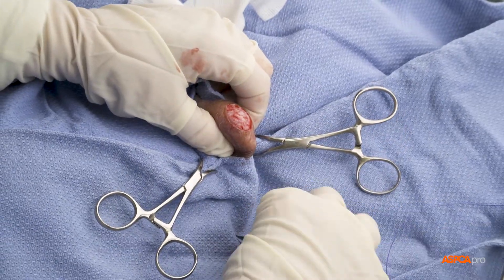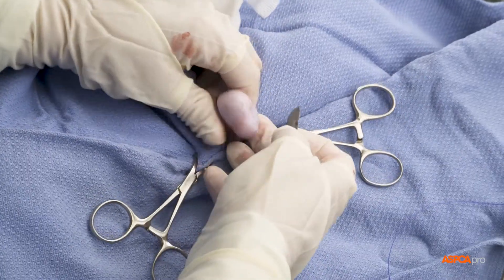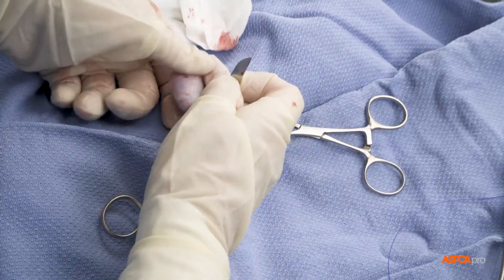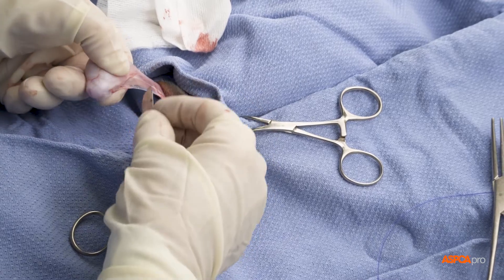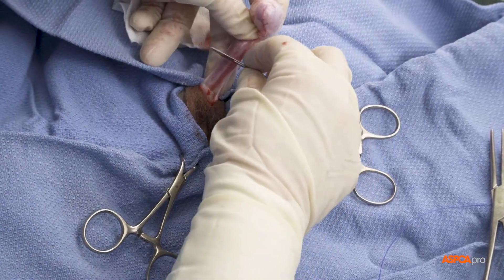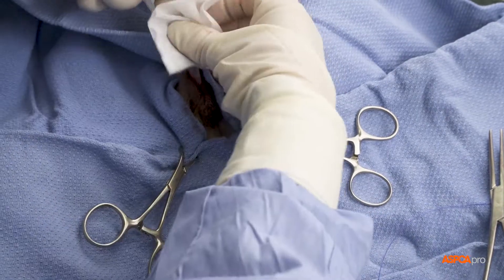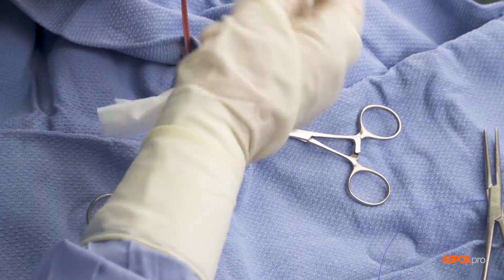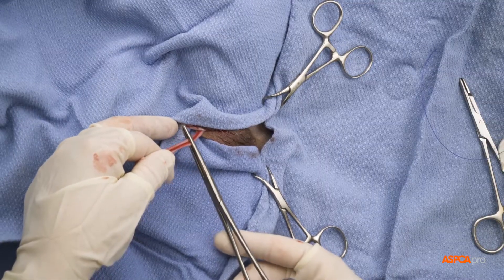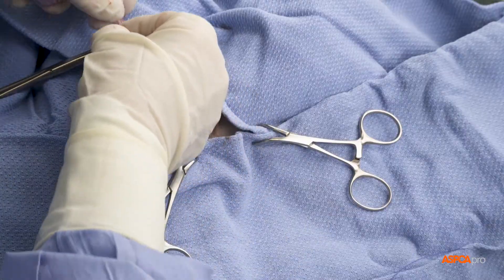This process is then repeated on the other testicle, bringing it through the same skin incision. The cord is cleared of fat and tissue, with gauze also used to strip the tissue manually. An indent is made to set up the knot, the clamp is placed on the cord, and the testicle is cut away.